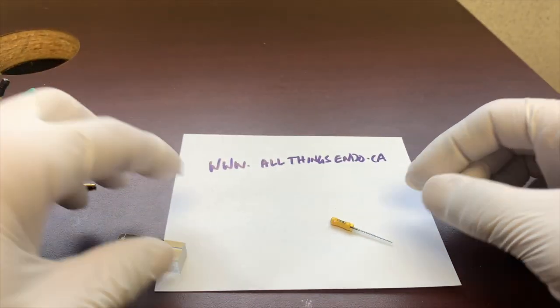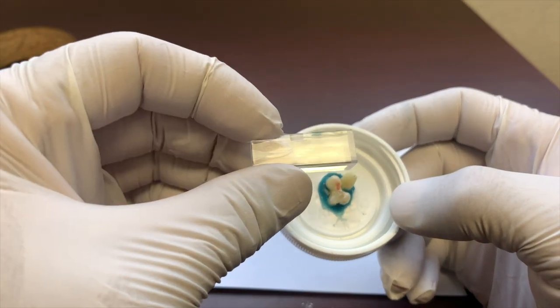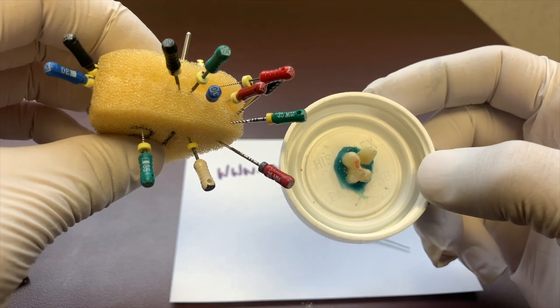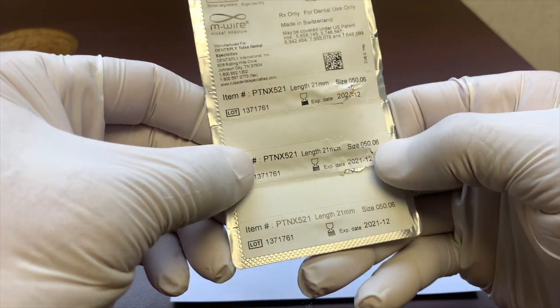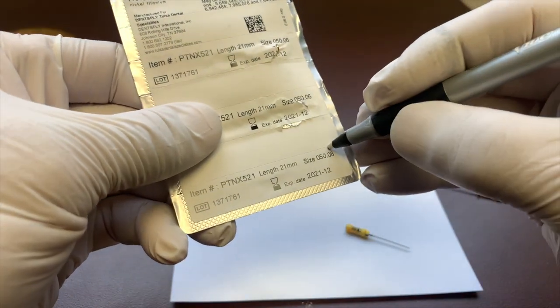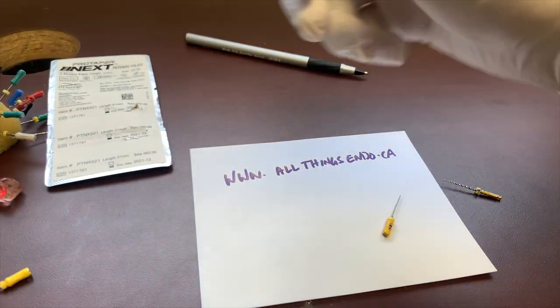So let's go ahead and take a look at this situation here. That's our apical, going around curves. Let's talk about using it in a real life situation. So this is ProTaper Next. It's a 5006. You can see the 5006 right there. So 5006, is this?